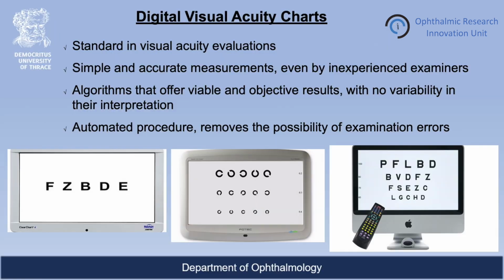Digital charts have been standardized for visual acuity examination, mostly due to their simple and accurate measurements, which can be easily conducted even by inexperienced examiners. These charts use algorithms that offer viable and objective results, without the danger of variability in their interpretation. Finally, the visual acuity evaluation follows a strictly automated procedure, which removes any possibility of examination errors.